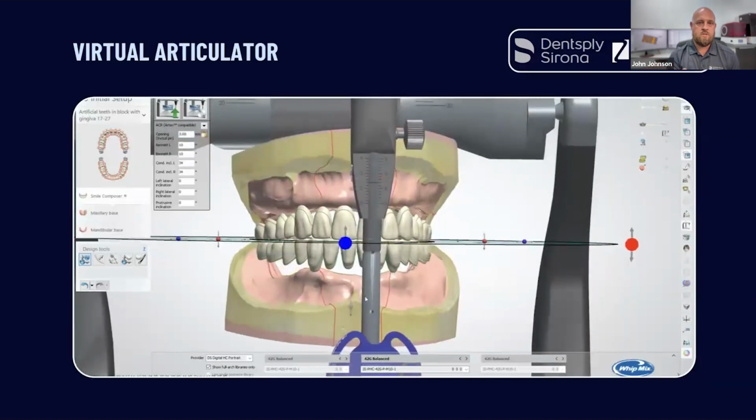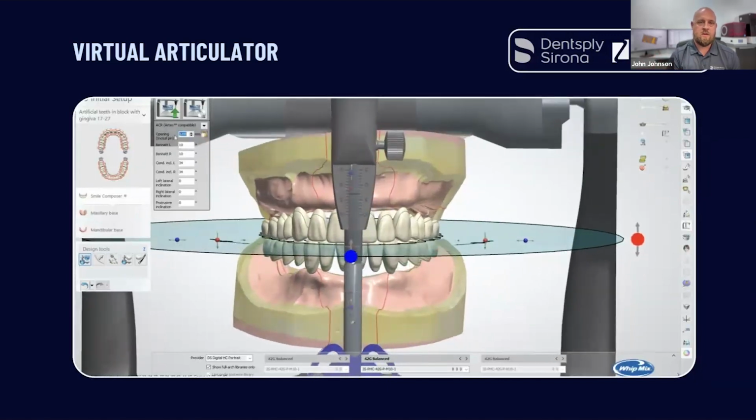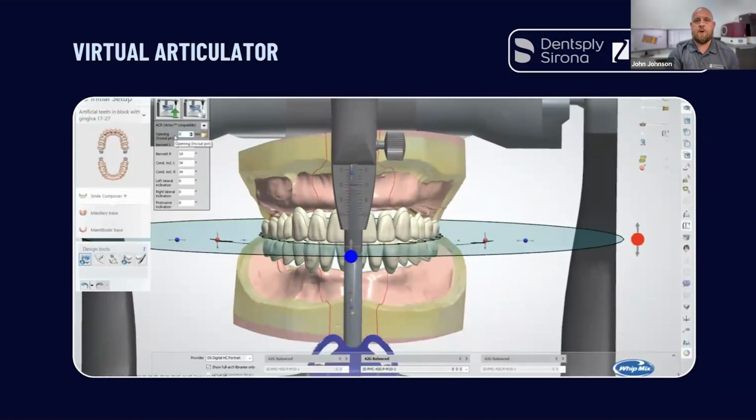And then all you would do once you do that is hit the lock, and that locks you in place. So it still gives you the freedom to utilize the digital articulator the same way you would as if it was in your hands.